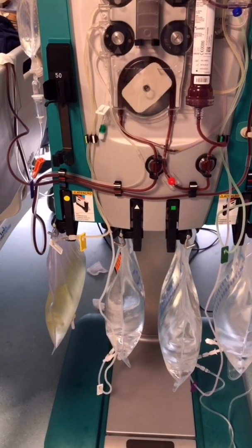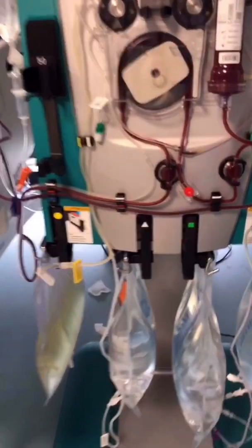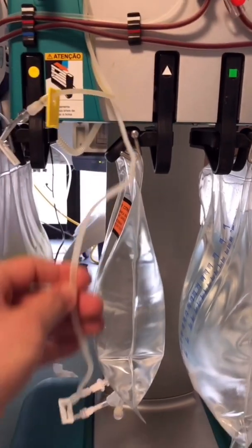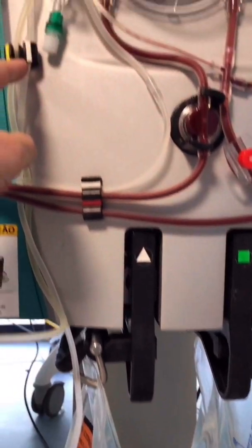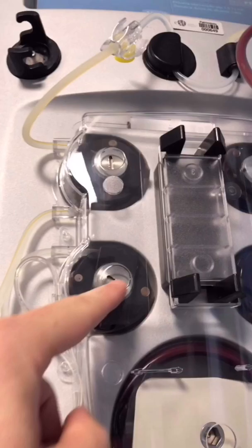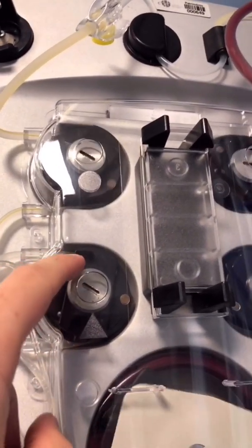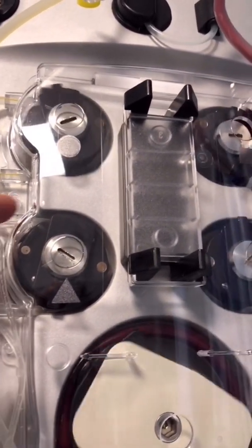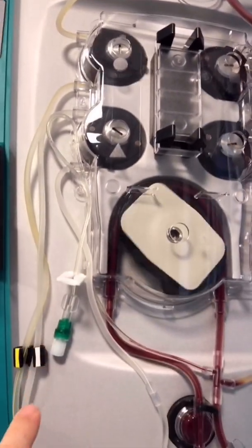Now we are going to check the citrate line. The citrate line is the white line — it goes up here and this is the citrate pump. In this patient, I've turned it off because his ionized calcium was below 0.8. This pump then goes from here down.